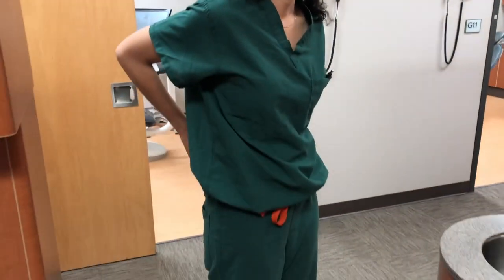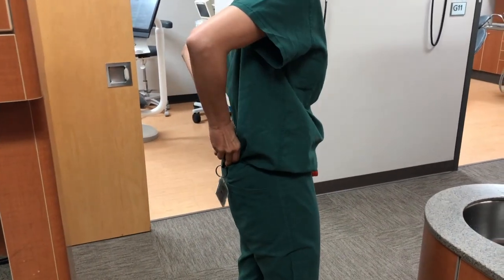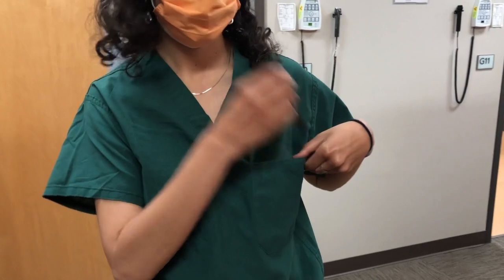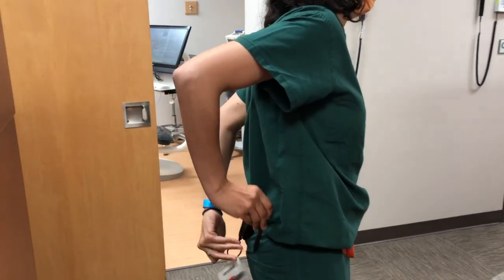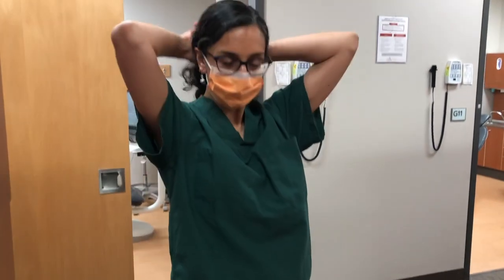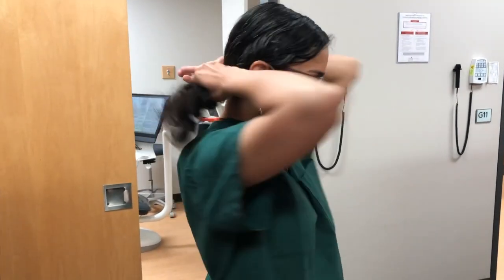Move your UT badge to the back of your scrubs so that it is still accessible after you put on a gown. If your badge is mounted on an extendable clip, you'll be able to swipe your card at computers without removing and replacing your badge. Remove also your pen and put it in your back pocket so it too is accessible.